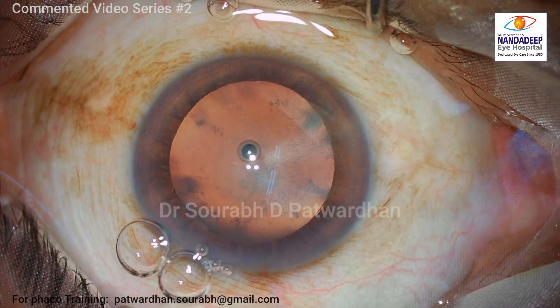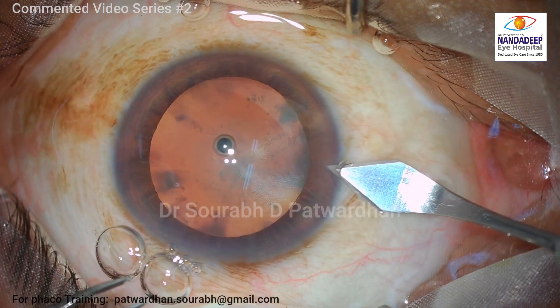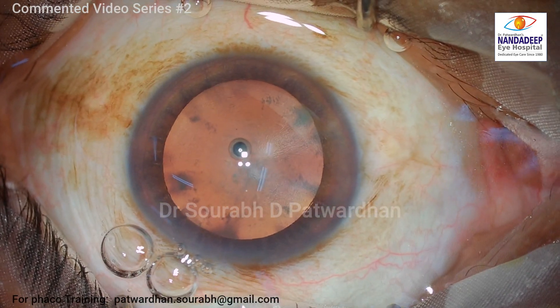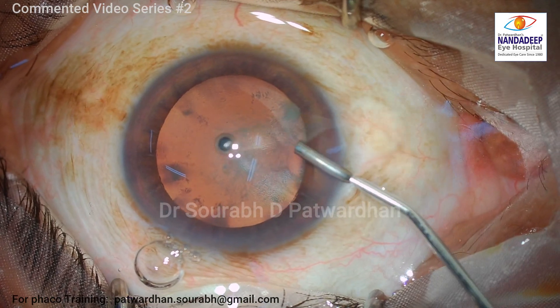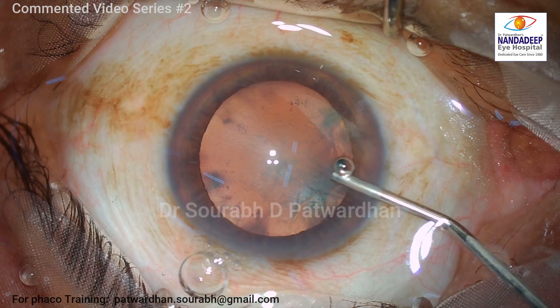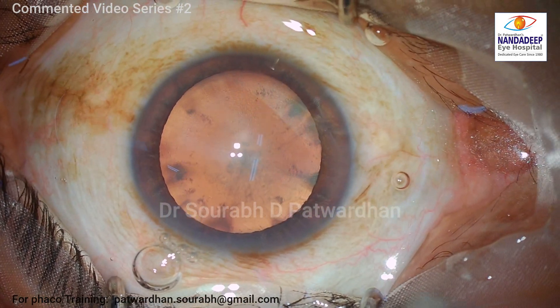Generally, as we know, with age the lens thickness increases. At birth it is around 3.5 millimeters, and by the time the patient reaches 60, it is more than 4.5–5 millimeters — sometimes in intumescent cataract it can be 5.5 also. So at the age of 45, we expect the thickness to be at least 4 to 4.5 millimeters, but in this particular case it is quite thin.